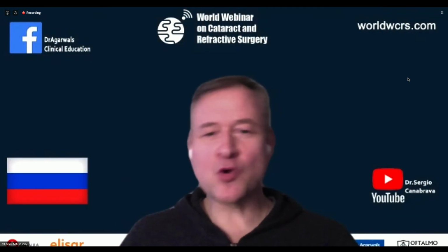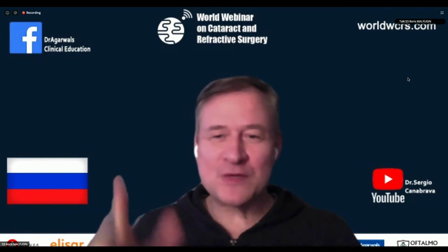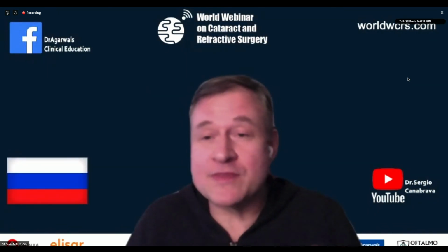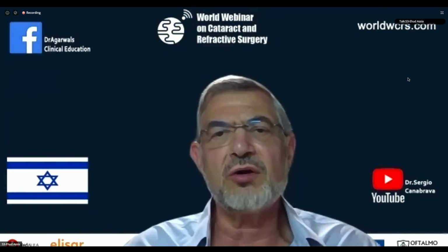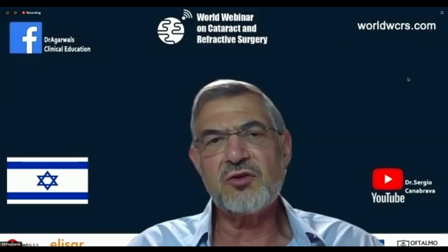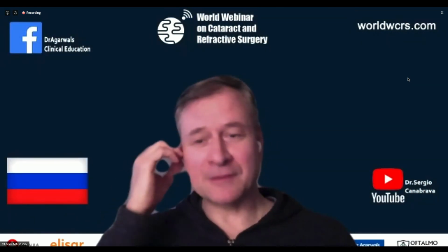Okay, because sometimes with the hooks, when the eyelids are tight and narrow, we like to cut them to make them smaller, which is obviously not possible with that device. This is correct, but hooks are very long, much longer. This is why they sometimes extend beyond the surgical field of the eyelids, but the APX is much smaller. Okay, good, great point.